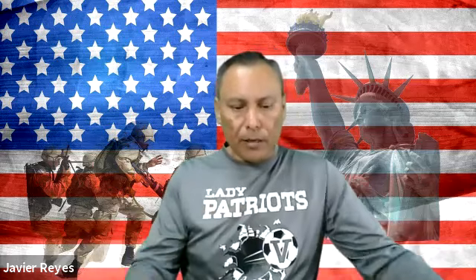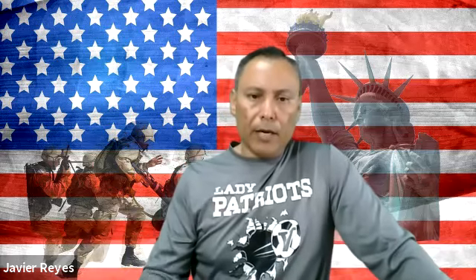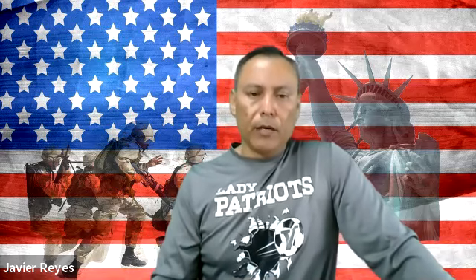General transportation guidelines. How do you transport these tubes? In the hospital, where you have the lab probably on another floor, you're going to be carrying them in biohazard bags. I think we talked about this before. What is a biohazard bag? It's not just a Ziploc, right? It has to have the logo, that orange symbol. It has to have a seal, a liquid tight closure, like the Ziploc. And then it also has to have another pocket on the side where you're going to put paperwork. So those are the three components of a biohazard bag.